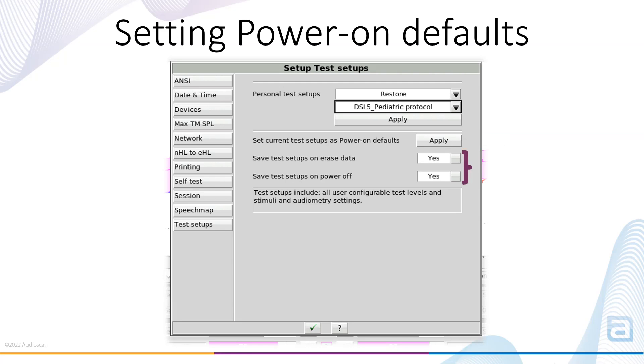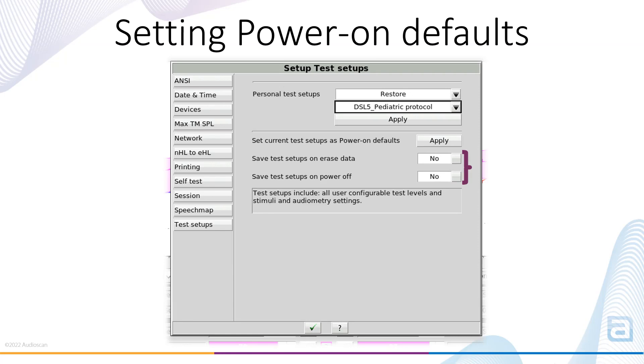The Yes-No toggle set whether restarting or clearing the session data keeps your changes that you have made during your SpeechMap or Insertion Gain measurements, or whether the system reverts back to your Power On default. If you mostly use a single protocol and you want the system to always start with the Test Setup for this protocol, then setting both of the toggles to No is recommended.